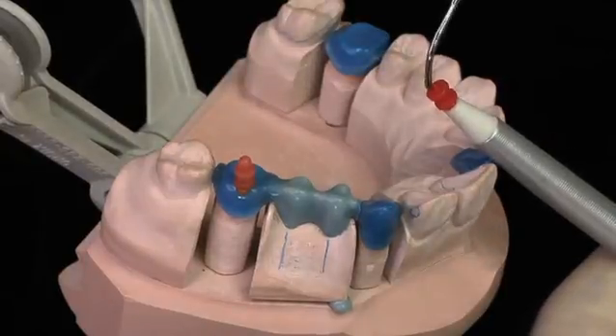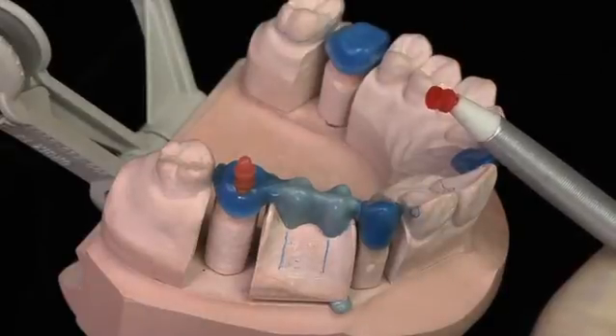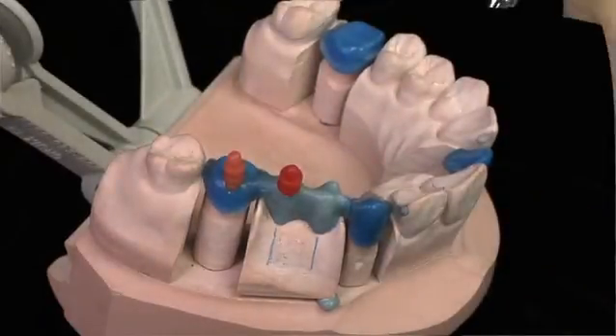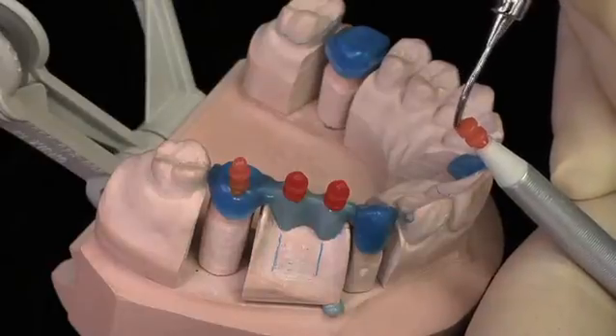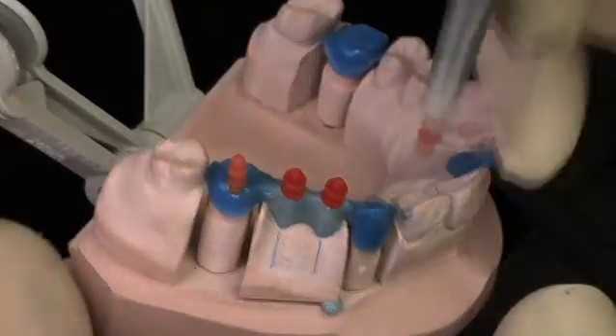Just wet the tip of the sprue and place it in position. My last pattern is the mesial abutment of the bridge and it really requires only the eight-gauge sprue. Wet the end of the sprue and set it.